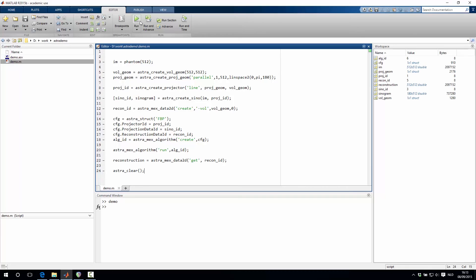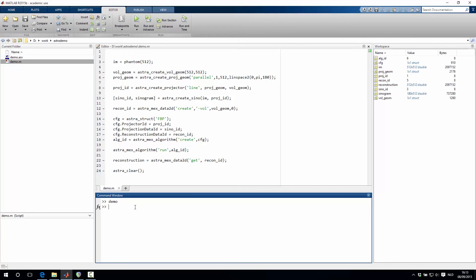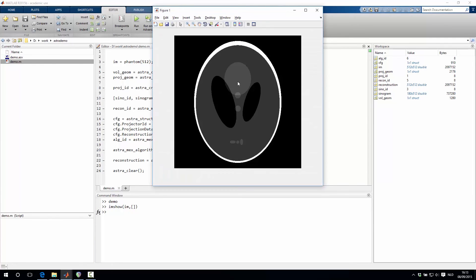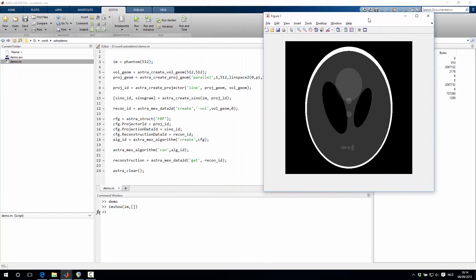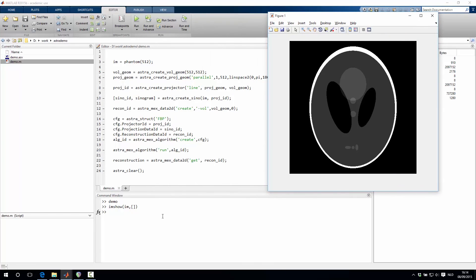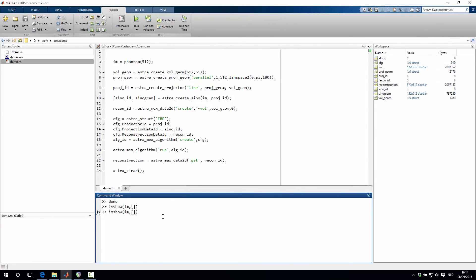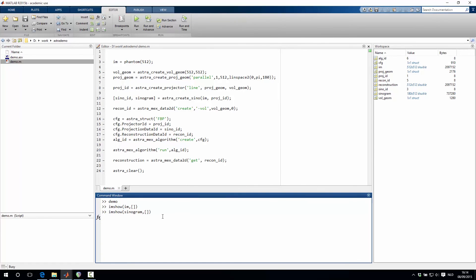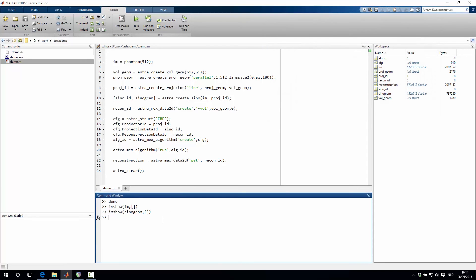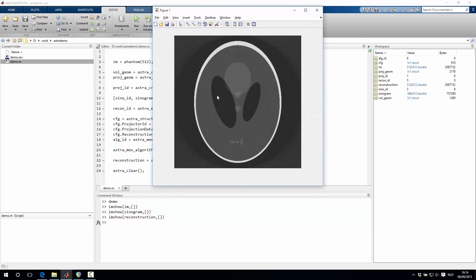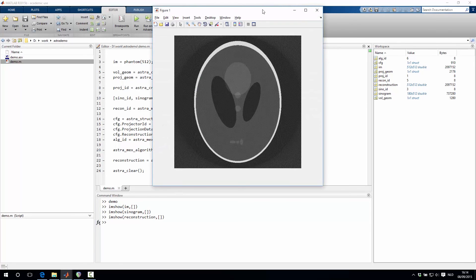So we can now run this script and then we can visualize all the things that we've done. So let's first visualize the original phantom image, which is this 512 by 512 Shepp-Logan image. Next, I'll show you the sinogram, which is a 512 by 180 image that you see here. And then finally, we can show you the reconstructed image, which is this image right here.